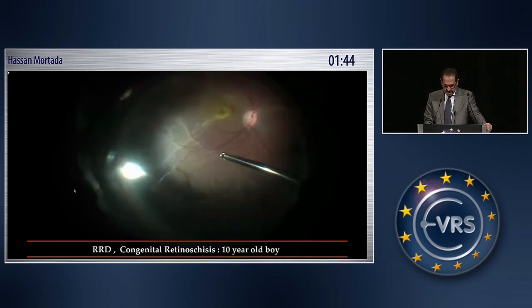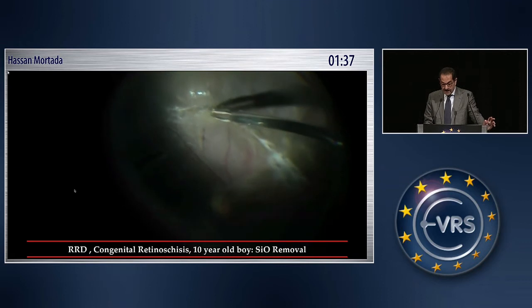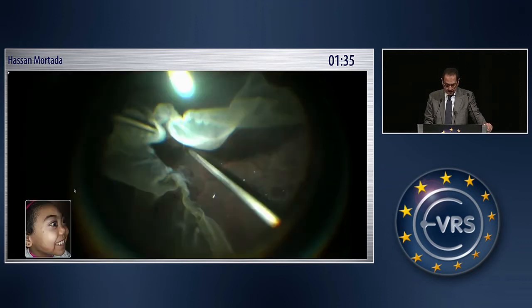This is the case of congenital retinoschisis. The same technique was done, and at the time of silicone oil removal there is proliferation on the nasal side where the ILM was not removed.